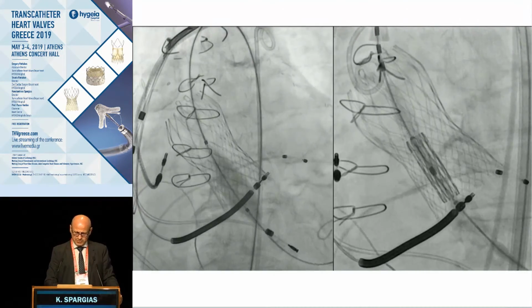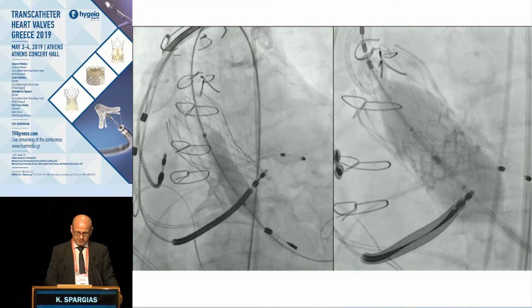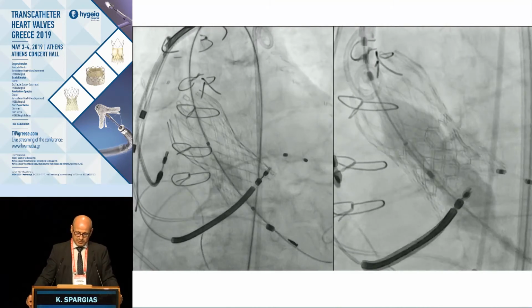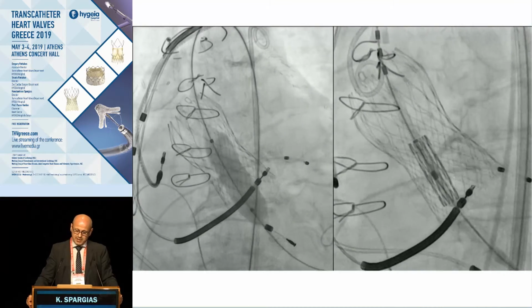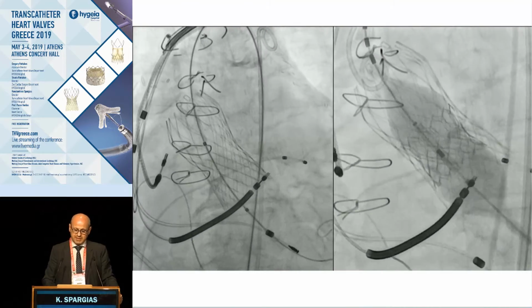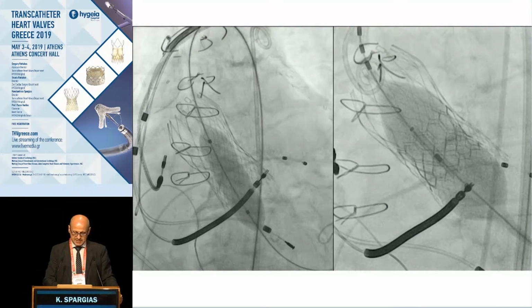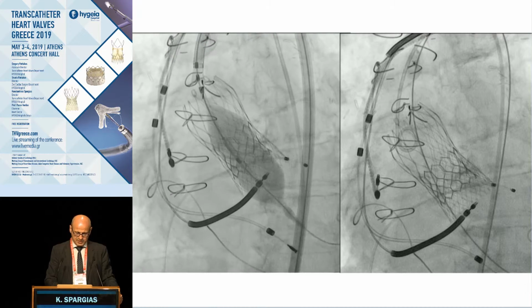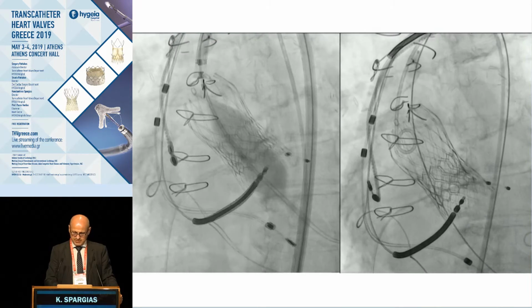It was a patient with renal failure, so if I remember correctly, it came back after 4 or 5 years with restenosis, and you see how we opted for Sapien within the Evolut, because this also gives you less metal, it keeps the one layer of metal, so access to the coronaries doesn't really change when you implant a Sapien within the Evolut, and post-dilatation to achieve a larger diameter, and this was our final result.